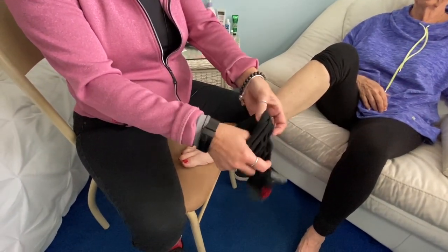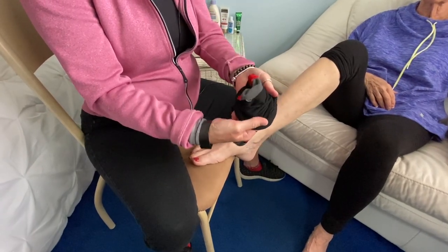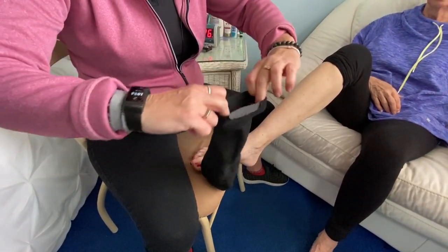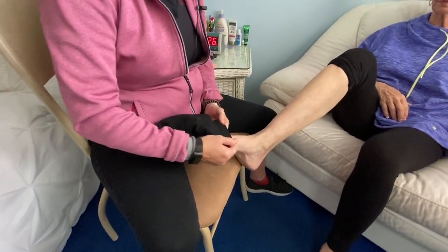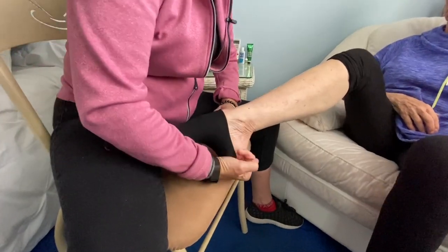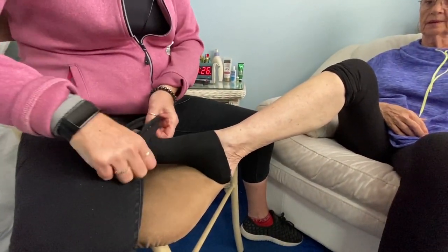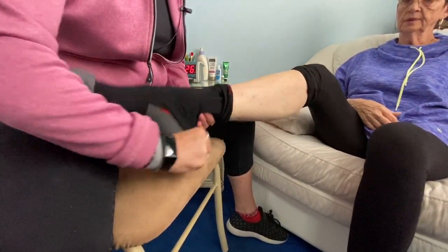So, you roll the sock like so, all the way to the heel. Once you get to the heel, you flip it inside out — it's kind of like a little sock puppet. You slip the sock onto the foot, covering the heel, and then just work the rest of the sock all the way up the leg.